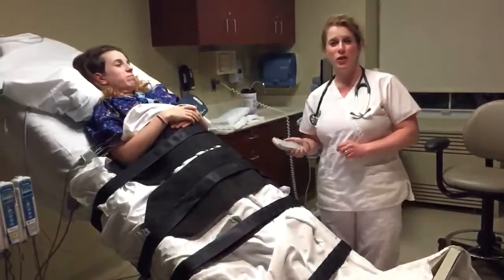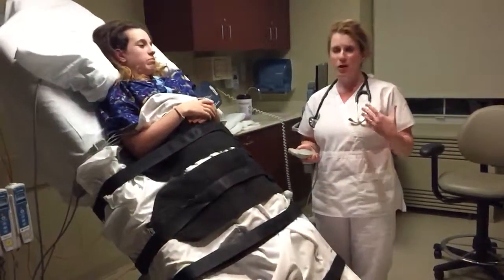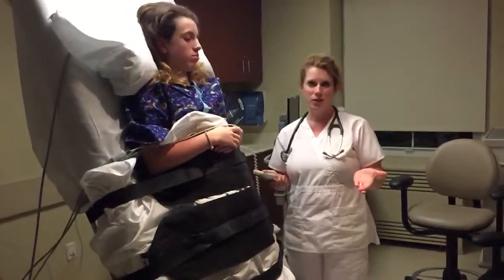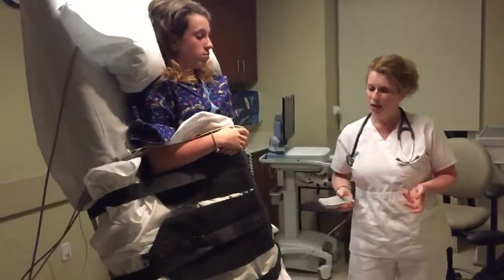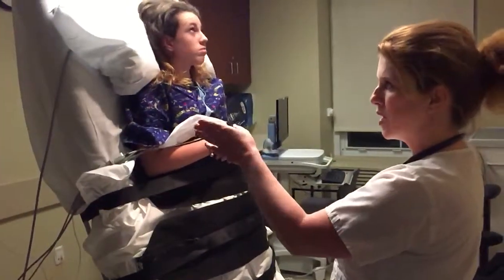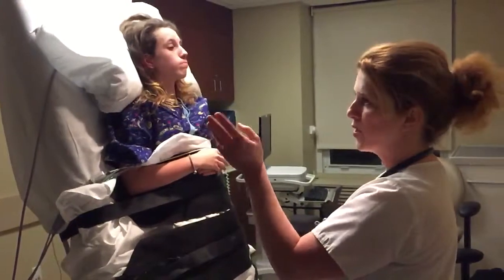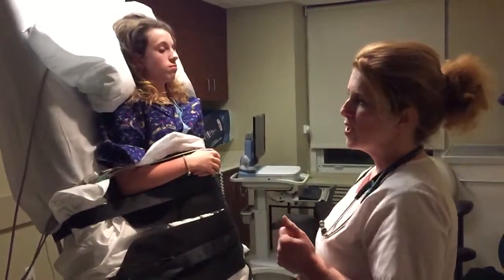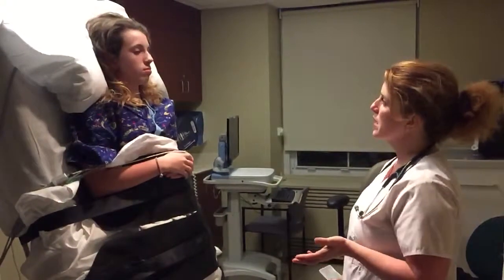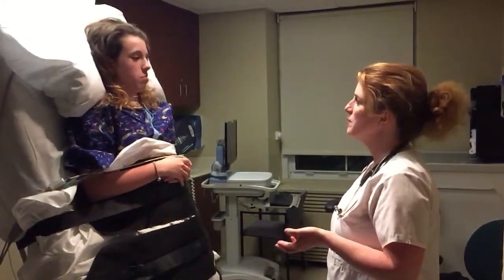To about 70 degrees. Some places might use anywhere between 60 to 80. Hackensack likes to go to 70. And then we just monitor our patient. Every 5 minutes, we are watching their blood pressure, their pulse, their heart rate and rhythm, their respirations, and their O2 sat. And we're asking them for signs and symptoms. How do you feel right now?